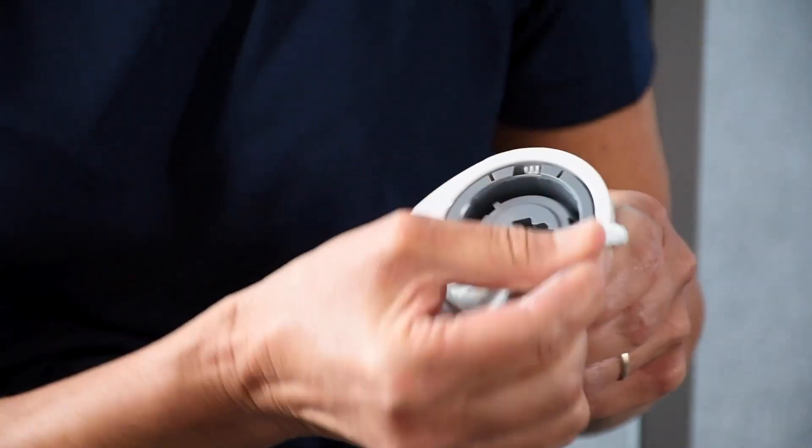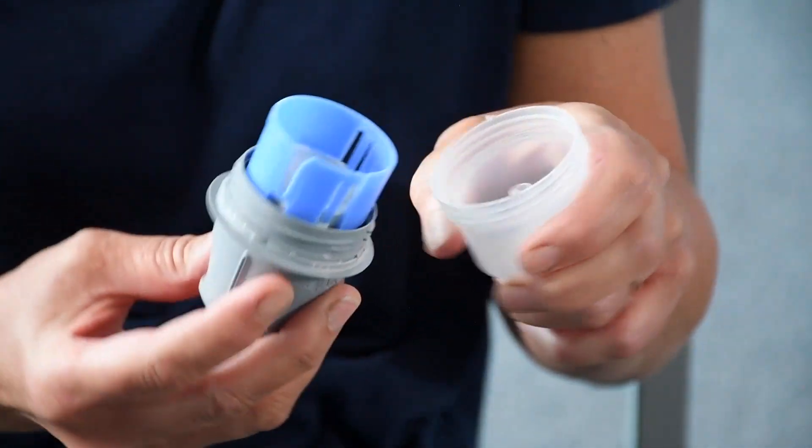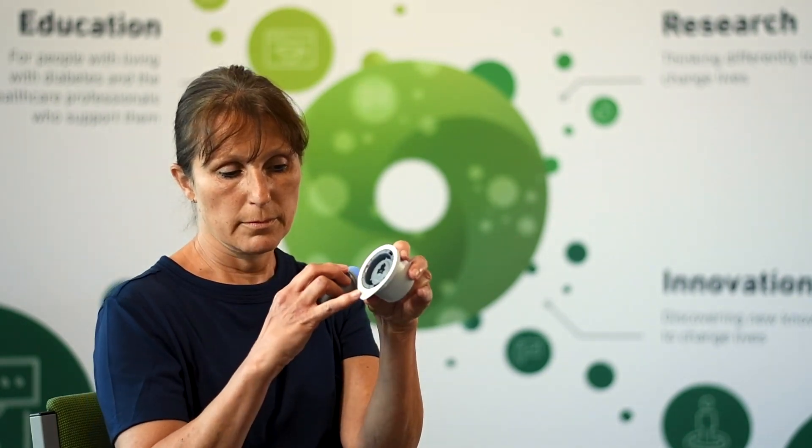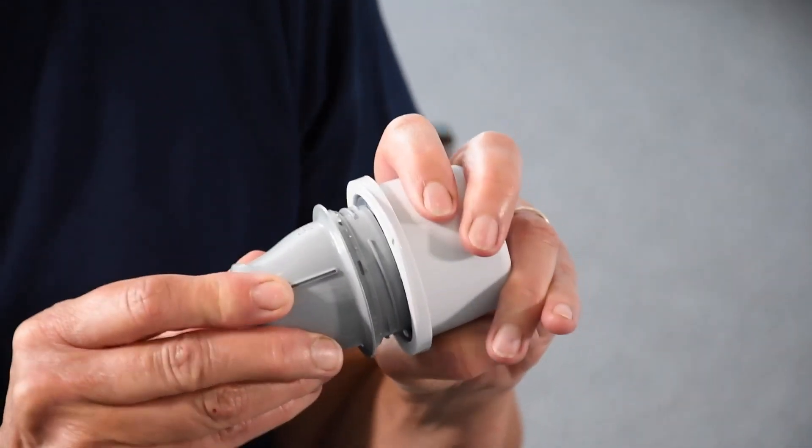Peel the top off your sensor pot and keep the foil as it has your serial number on it. Put the pot down and lift up the applicator — you will need to unscrew this and it can be quite tight. Put the clear pot down and pick up the sensor pot. You will see a line on the lip of the sensor cup and a line on the applicator — you need to marry these two up and push down.